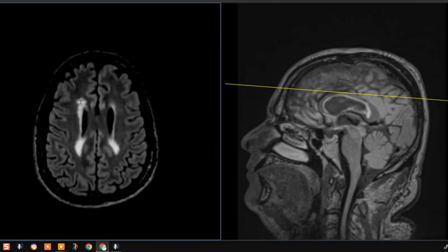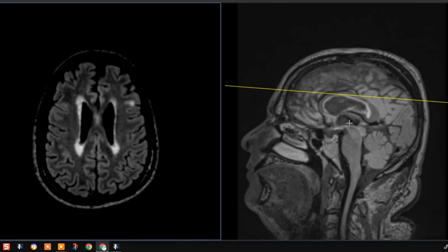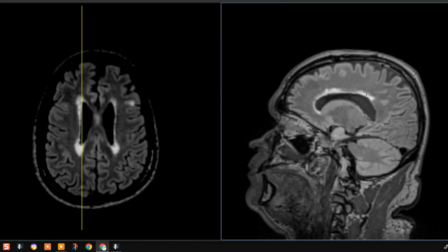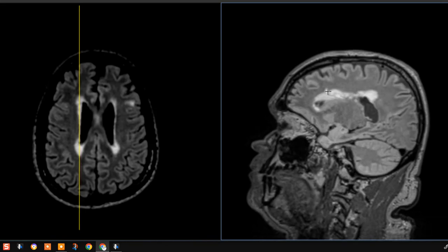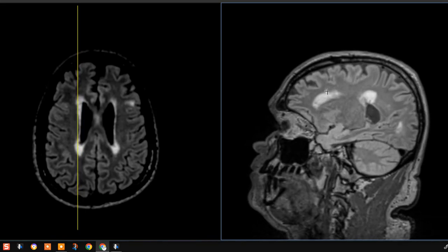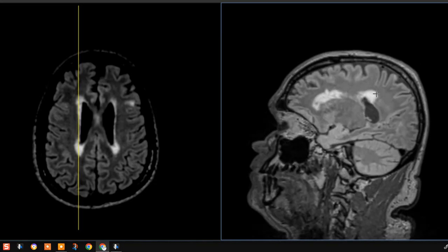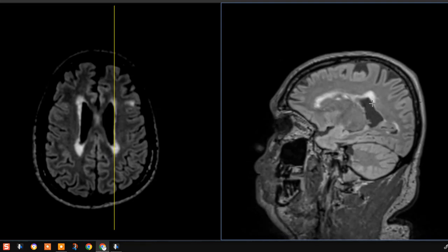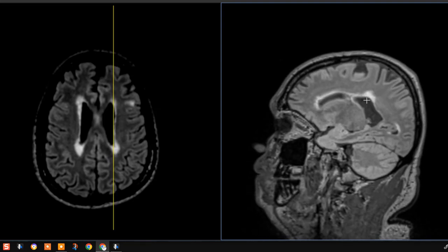In this case there's a little horizontal lesion here that's very typical — a little transverse vein of bright signal. And if we look on this view here we can see these same lesions hugging the ventricles. There's one right here that radiates outward, typical for multiple sclerosis. Over here more of a globular appearance. There's even a little bit of atrophy associated with this one — the ventricle pokes out underneath because there's atrophy of the brain parenchyma.